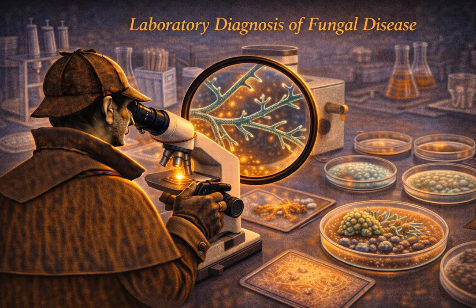They grow incredibly fast and they are extremely fuzzy. If just one spore from the air lands on your patient's plate, it will cover the entire thing in 48 hours, completely ruining your chance to find the slow-growing pathogen underneath. So cycloheximide kills the fast-growing environmental weeds. That sounds perfect.